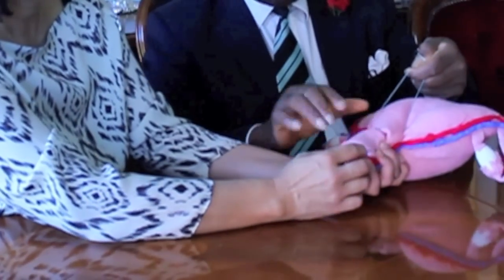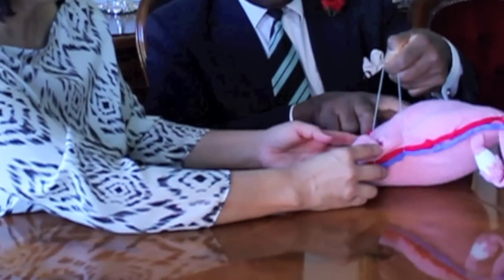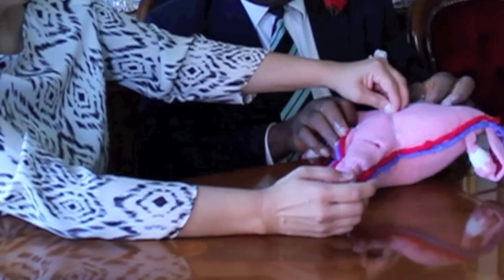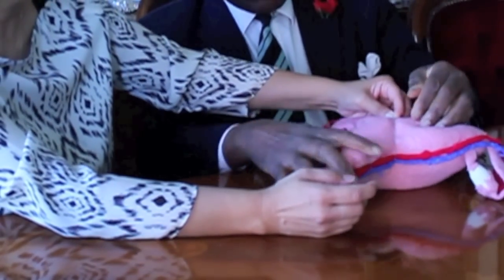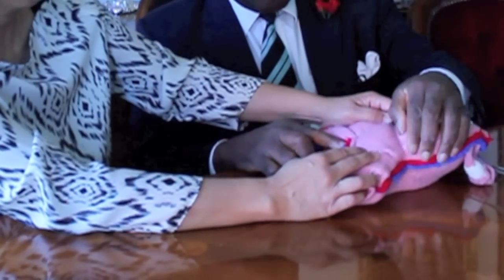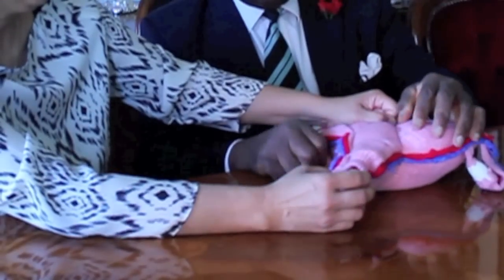If you let go, you see the compression of the lower segment which is achieved. The lower segment is now compressed by occluding the vascular pedicle on each side, achieving control.